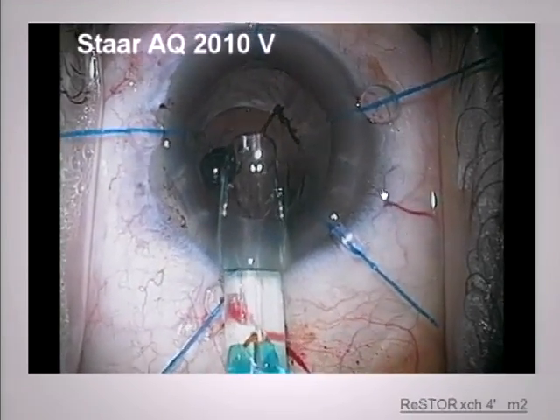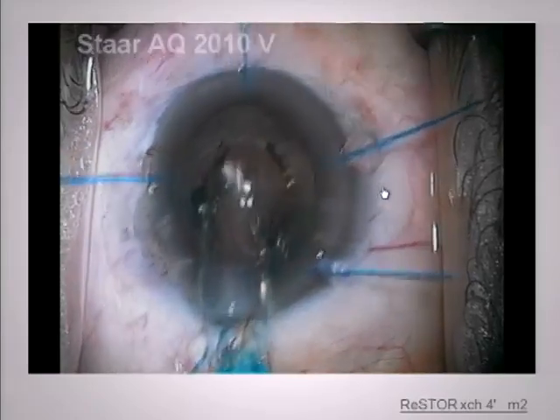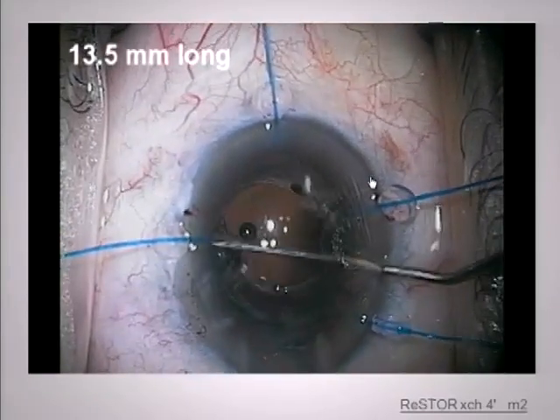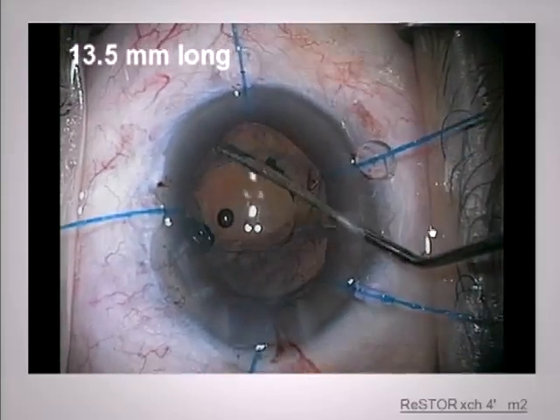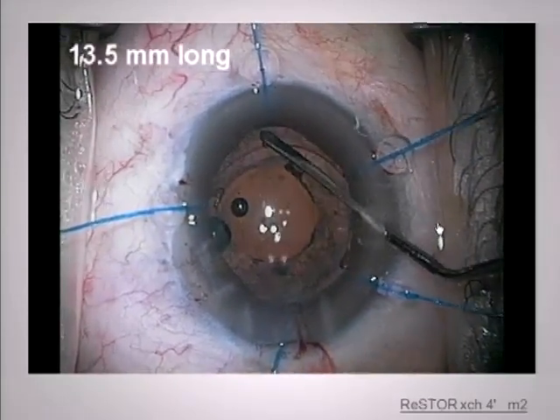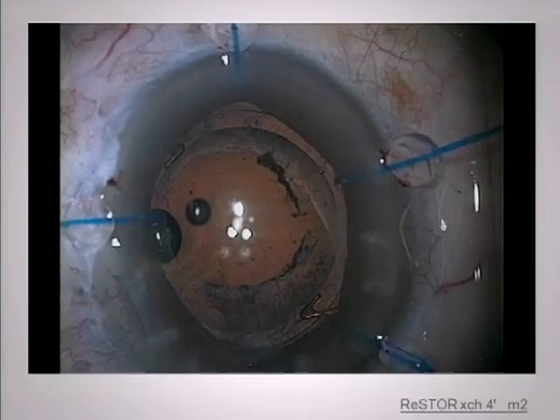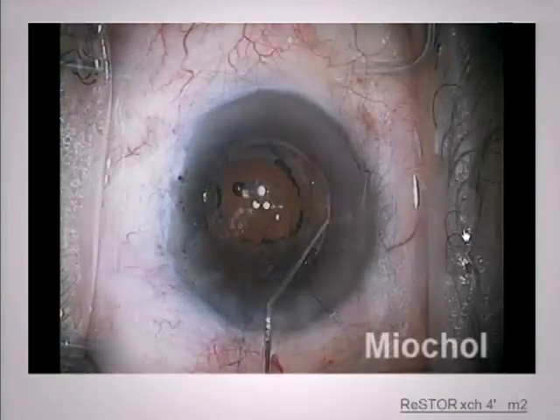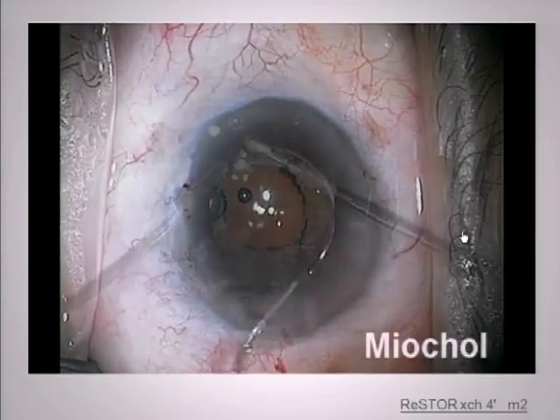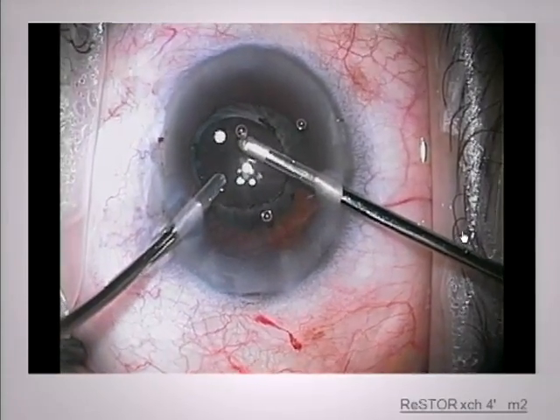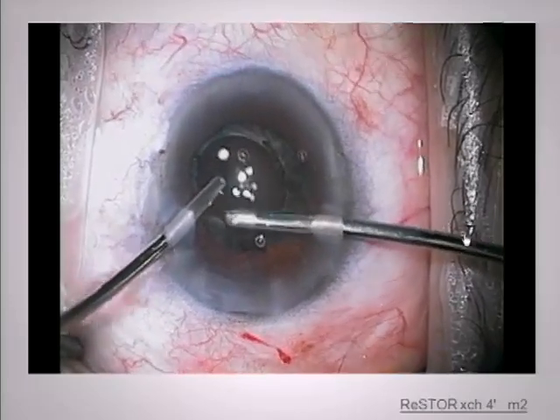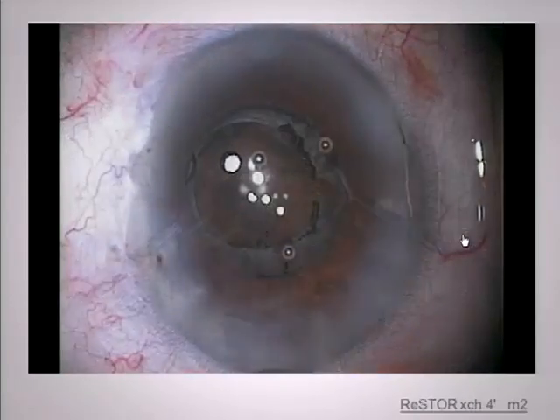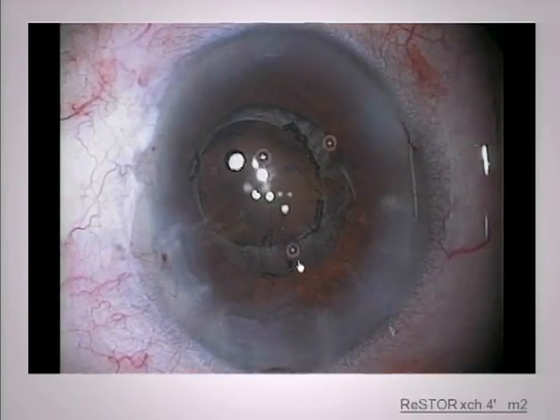My lens for the sulcus is typically going to be the Staar AQ 2010 because it's the only one that's 13.5 millimeters long, haptic to haptic. This is a case where, with that small of a rexis and it being fibrotic, I chose not to capture it. Prior to doing the I/A, I put in some miochol so that the iris overlaps the edge of the optic. So this patient has basically the haptics of the Restore, but a three-piece lens in the sulcus.